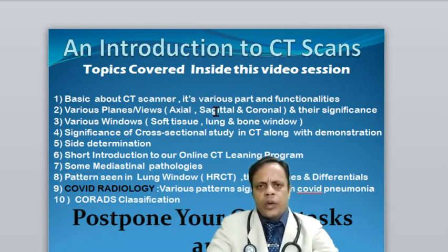We are going to discuss this and their significance also. Number three, various windows. You might have seen there are various windows. Some mediastinal windows are there. They look slightly different from the HRCT or lung window and bone window, and what are their significance.